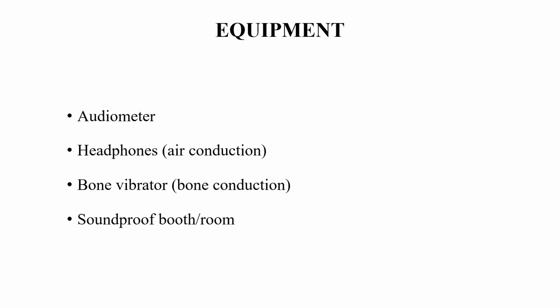So now coming forward, we'll look at the equipment needed to perform pure tone audiometry. So obviously, we should have an audiometer, then headphones for air conduction, a bone vibrator for bone conduction, and a soundproof booth or room.